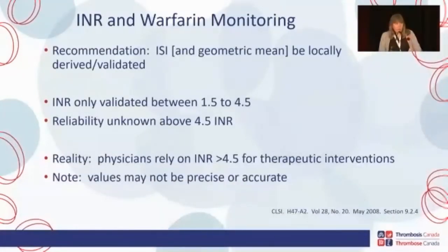So as I've already stated, the INR is used for warfarin monitoring. And it is best practice and international recommendations that the ISI, as well as the denominator, the geometric mean, be locally derived and validated. The other thing I want to bring to your attention is the INR is only validated between 1.5 and 4.5.